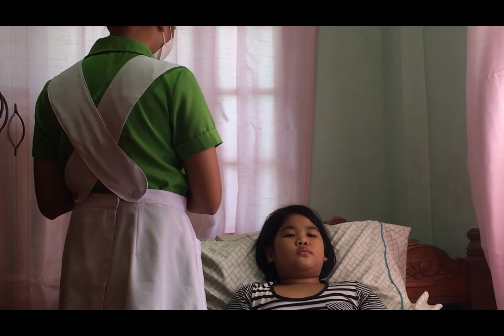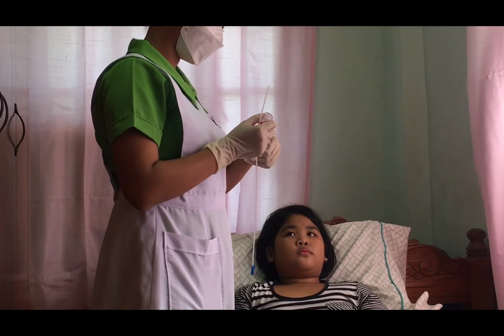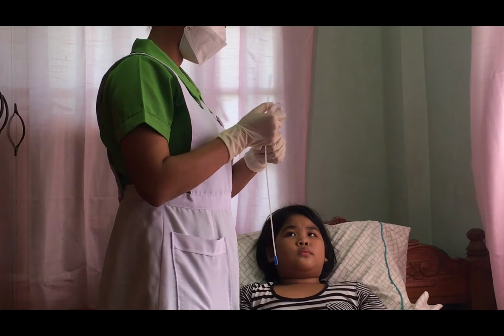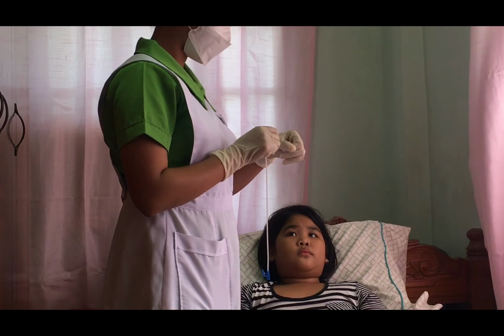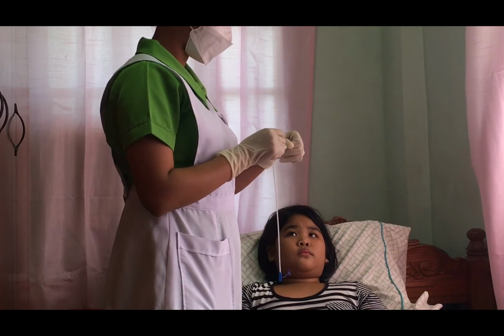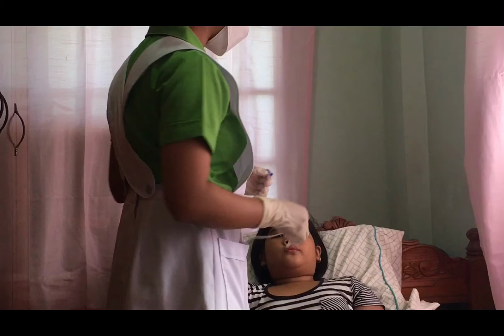Lubricate the tip of the tube 2 to 4 inches with lubricant. Pass the tube via the naris posteriorly down to the nasopharynx, then to the esophagus, and to the stomach.